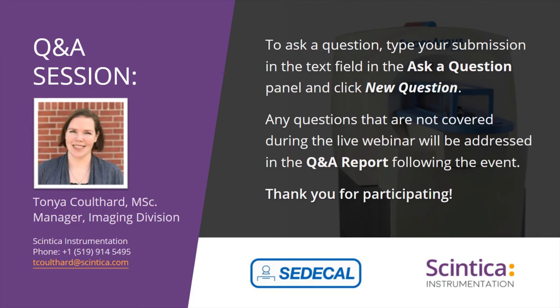Excellent. All right, great answer. Another question here, is the only option for multi-animal handling that 4-mouse configuration that you showed in the slides? So no, the configuration that I showed in the slides is the commercially available option that Sedecal has put forward. However, they've often worked with researchers directly to figure out a configuration that works to meet their needs based on their animal models and the studies.